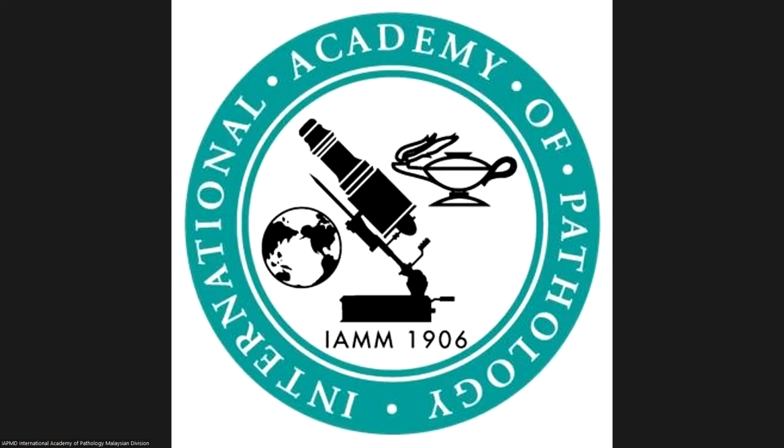You can give a broad interpretation saying that these two are of B phenotype. That is quite safe to say, but you cannot decide. The close differentials are nodular lymphocyte predominant, whatever variant pattern you're thinking of, and T-cell/histiocyte-rich large B-cell lymphoma. I would do that and ask them to excise a complete lymph node. Okay, thank you for the explanation.